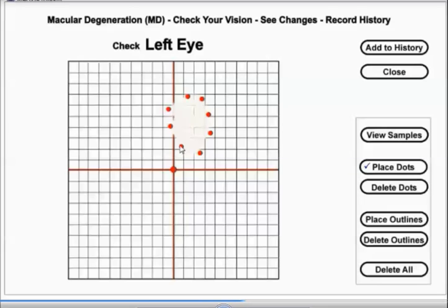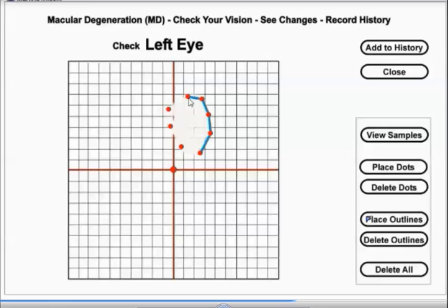Once you have successfully placed the red dots, click on place outlines. Then, very carefully clicking on the red dots, you're going to put in blue lines around the perimeter of the affected area.